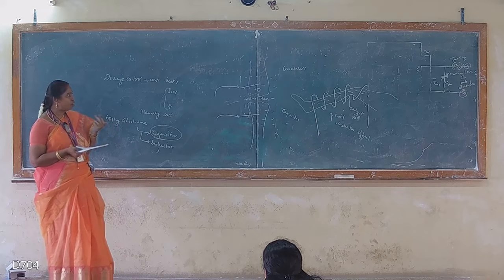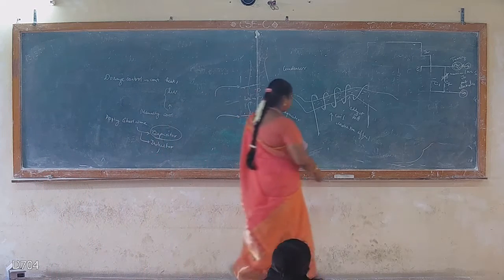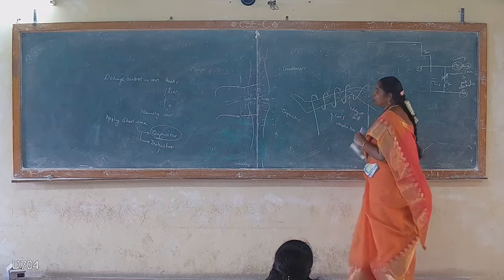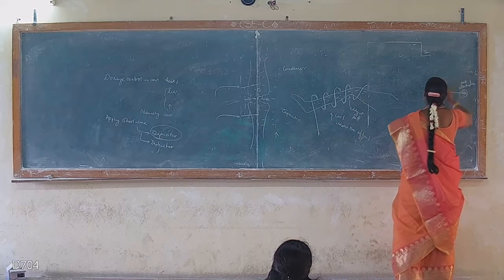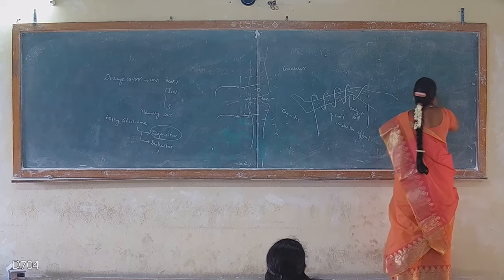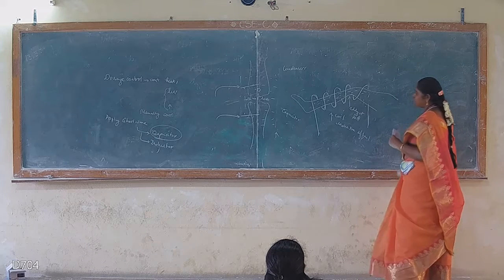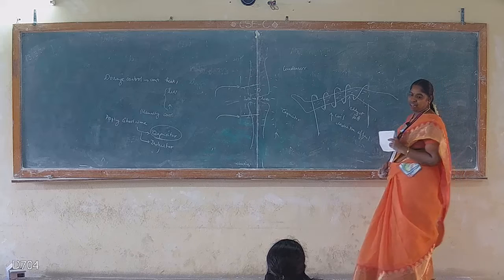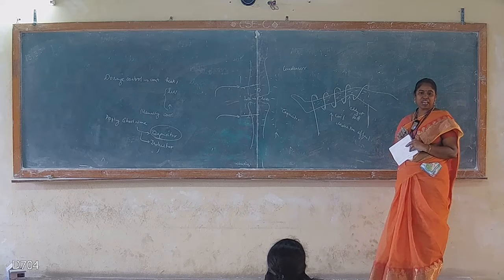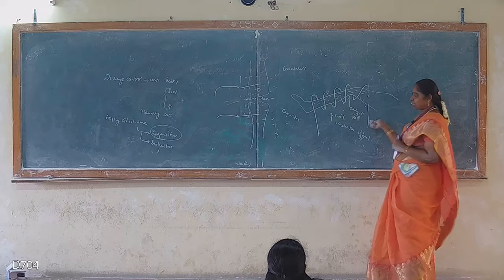So in order to avoid this, shortwave diathermy can be applied in some pulsed mode. Pulsed mode is nothing but giving a gap: for some amount of time we pass a high frequency current, later we provide some relaxation, and then again we pass the high frequency current.